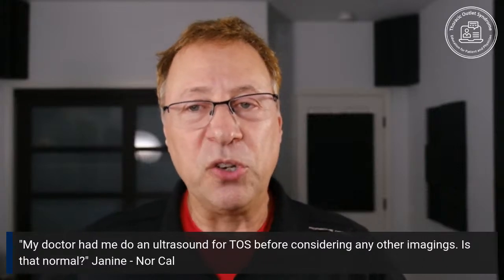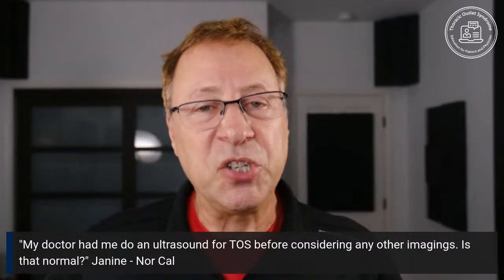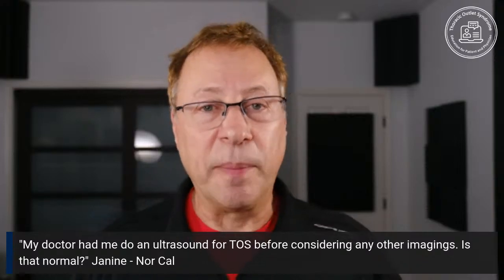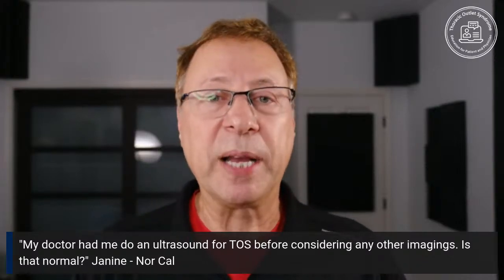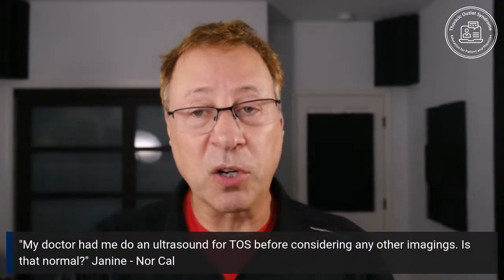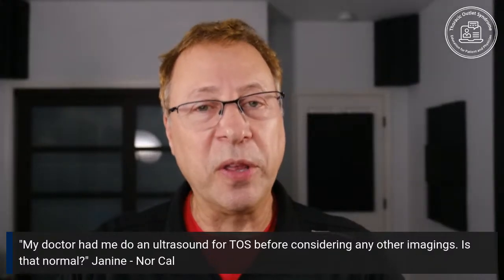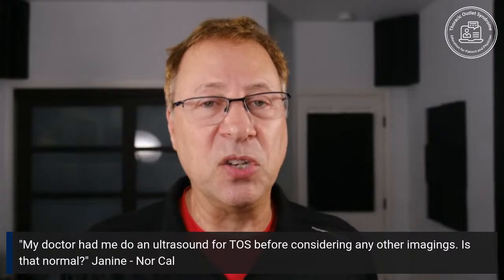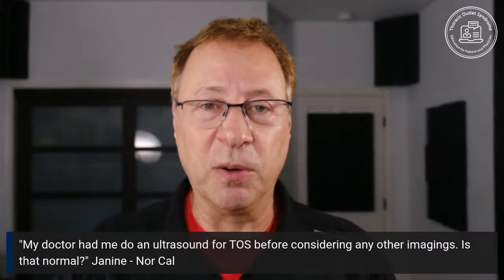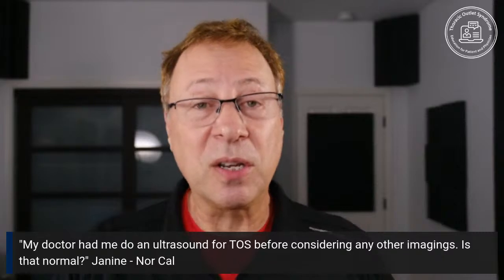You may recall when I showed the pictures of ultrasound and blood vessels, I said it works great. You can really see compression, but you can't see whether the brachial plexus is compressed. And this is critical. From my MRI studies, I know there are patients with brachial plexus compression who have no arterial compression, and vice versa. So compression of the artery is something that Adson did in the 1920s. His test, Adson's test, is meant to show whether the artery is compressed. He assumed in the 1920s that if he could show compression of the artery, he could assume compression of the brachial plexus. But Adson didn't have CAT scans, he didn't have MRIs. So that was the best anybody could do, and it was a clever test.